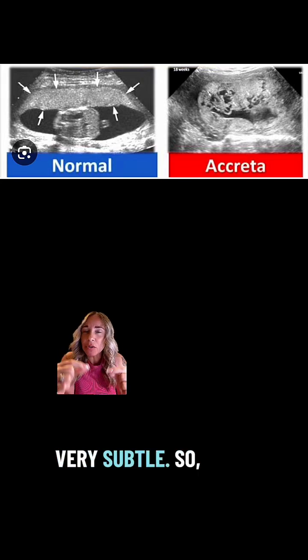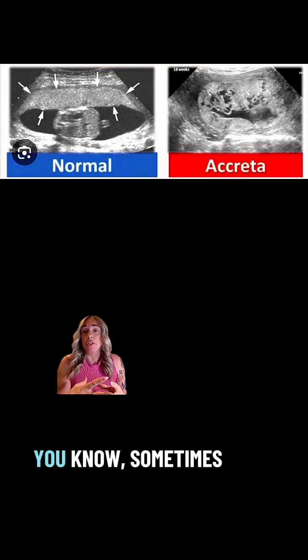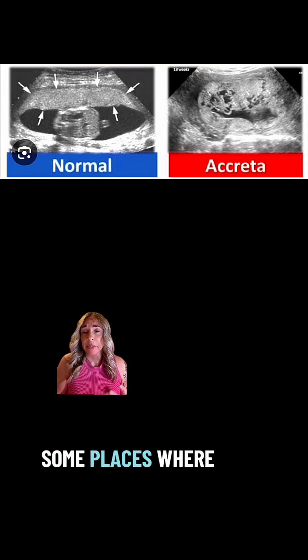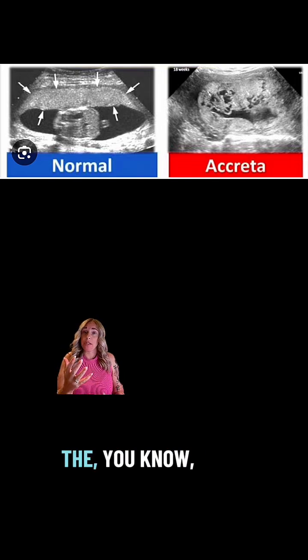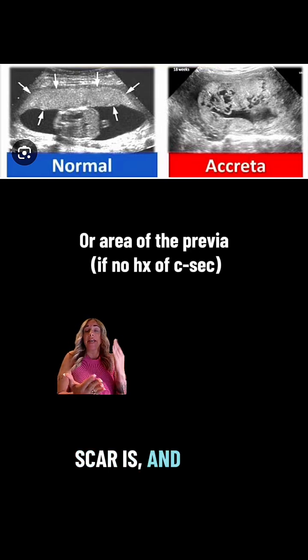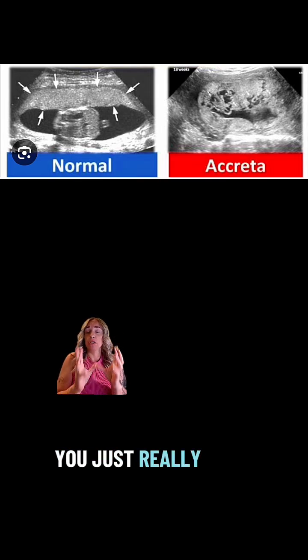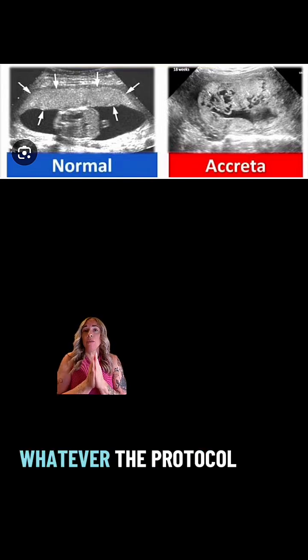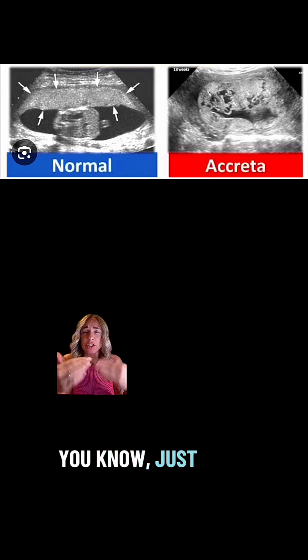Once again, very subtle. So, some MFMs have an accreta protocol. Whatever the protocol is, I worked at some places where they had you increase your image to where the C-section scar is, and you just take some live clips, you put color on, and you really get deeply magnified into that area. Once again, whatever the protocol is at your site, follow it, and just train your eye.